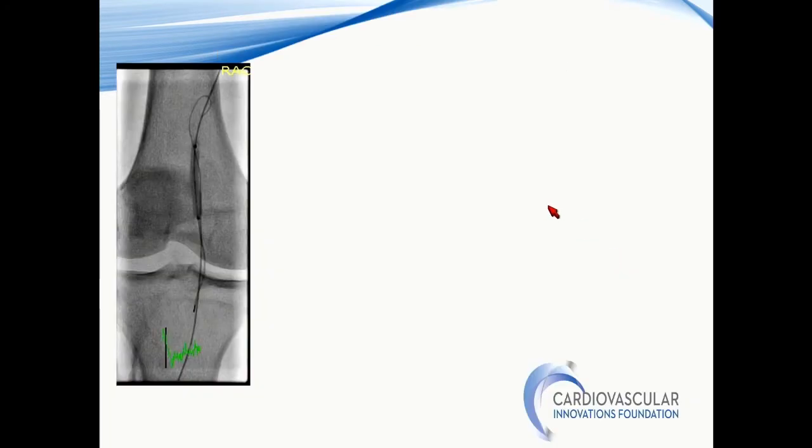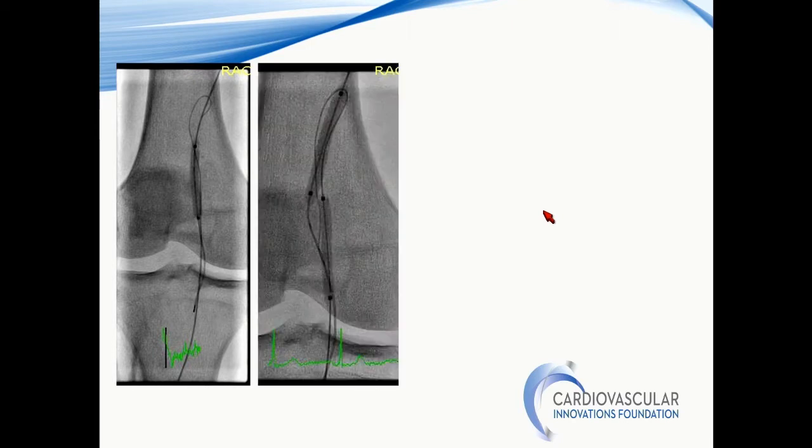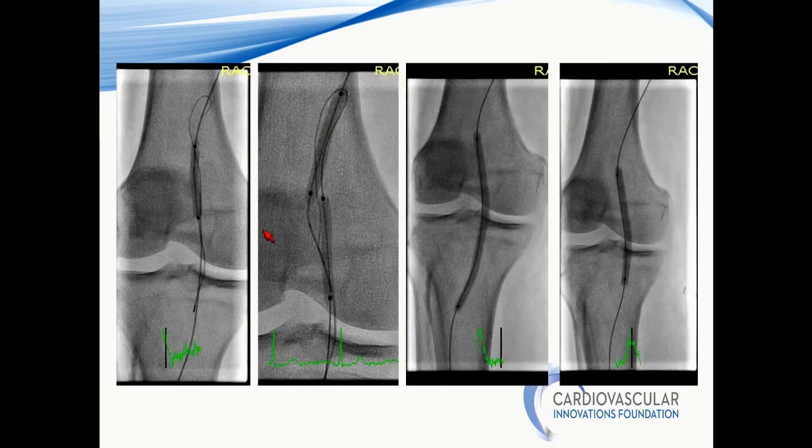And we crossed the lesion. We were subintimal at the time. So now we have to get re-entry. So again, the same techniques we discussed yesterday. We did CART, reverse CART, parallel balloon, and we are finally able to get through the lesion.